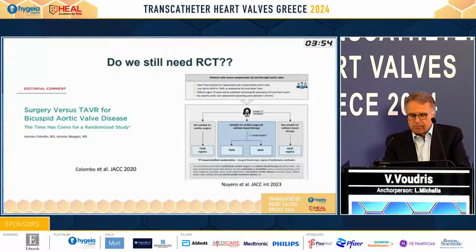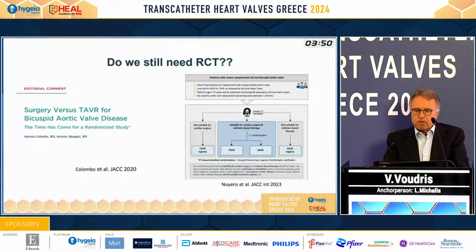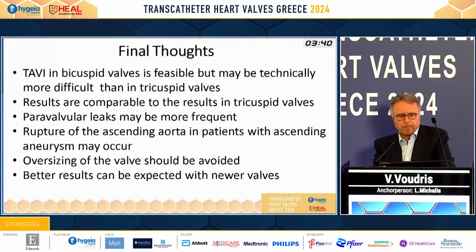But I think, based on the new data, it is time to have a randomized trial, surgery versus TAVR, for bicuspid aortic valve disease.